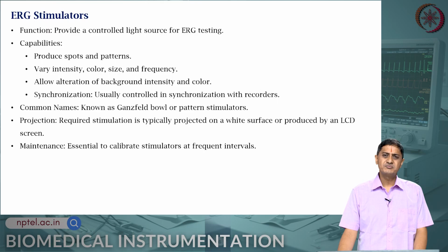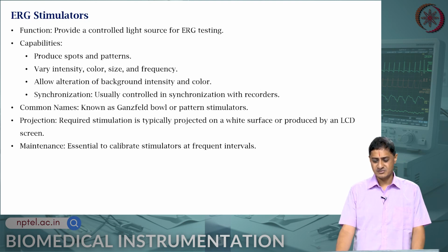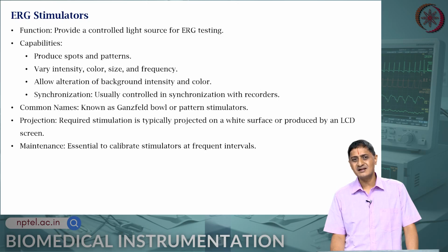The stimulators present a crucial aspect of the ERG testing. They provide a controlled light source. I already mentioned this, you need to prevent scattered light. So, they can produce specific spots and patterns, and they can vary intensity, color, size and frequency.